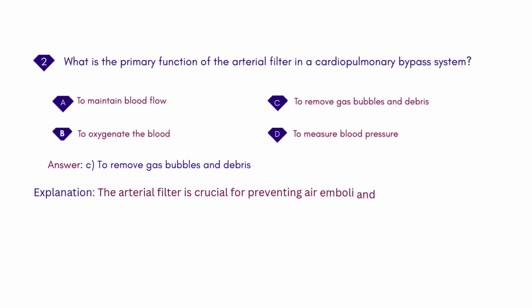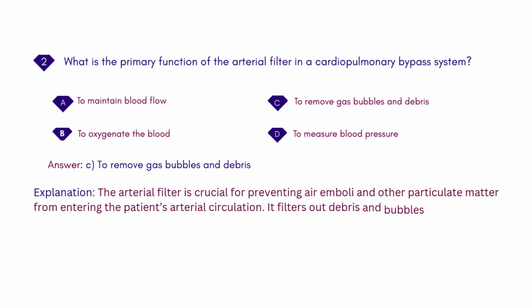Explanation: the arterial filter is crucial for preventing air emboli and other particulate matter from entering the patient's arterial circulation. It filters out debris and bubbles that may have formed during the bypass process.